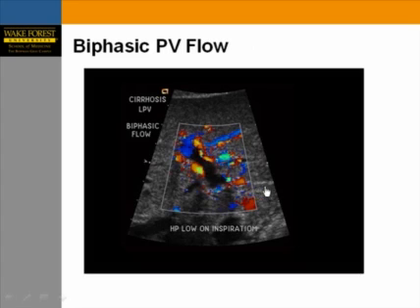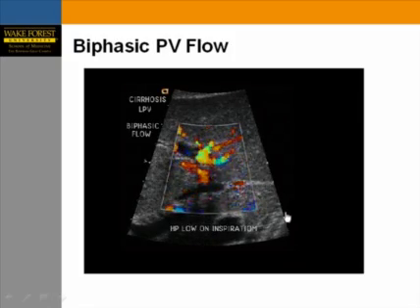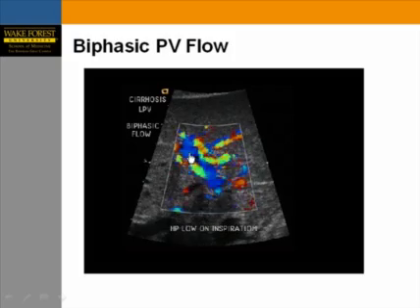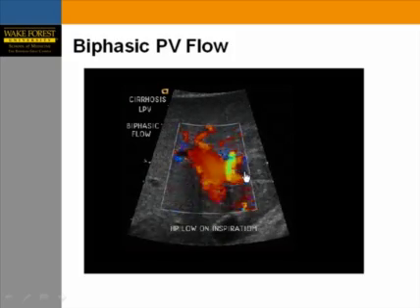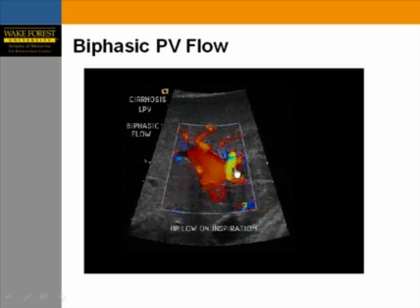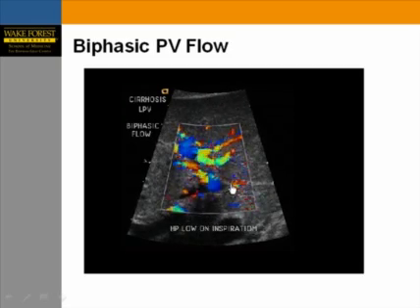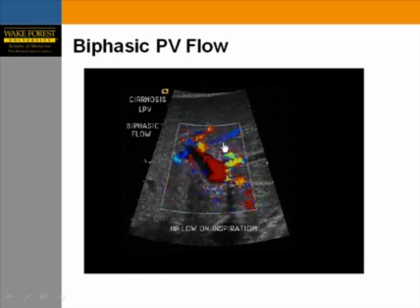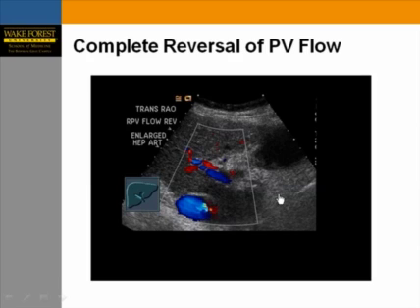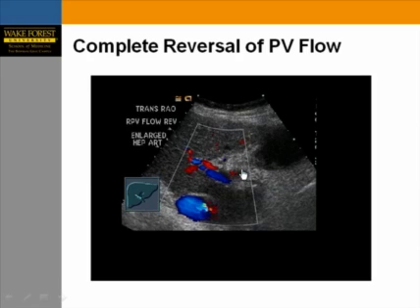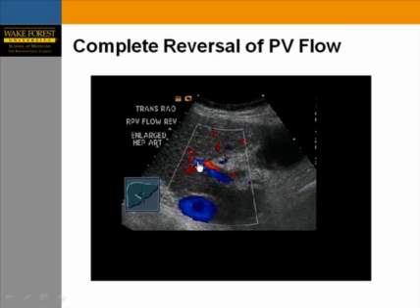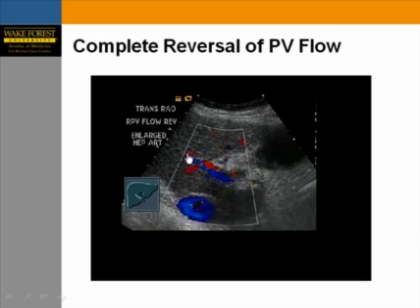This video clip demonstrates biphasic blood flow in the portal vein, indicating portal hypertension in this cirrhotic patient. Also note the nearby arteries are large and demonstrate color aliasing — an artifact you can use to your advantage. Another example shows complete reversal of the portal vein, with the nearby artery showing color aliasing.